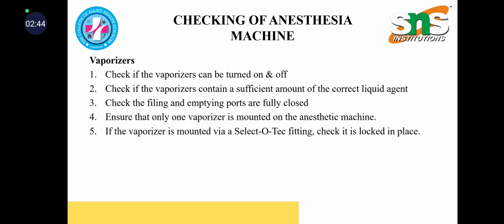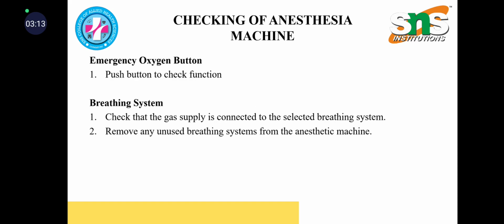Vaporizers. Check if the vaporizer can be turned on and off. Check if the vaporizers contain a sufficient amount of the correct liquid agent. Check the filling and emptying ports are fully closed. Ensure that only one vaporizer is mounted on the anesthetic machine. If the vaporizer is mounted via a Selectatec fitting, check if it is locked in place.